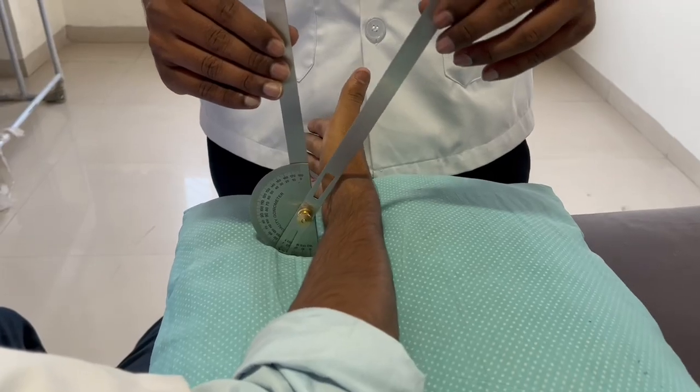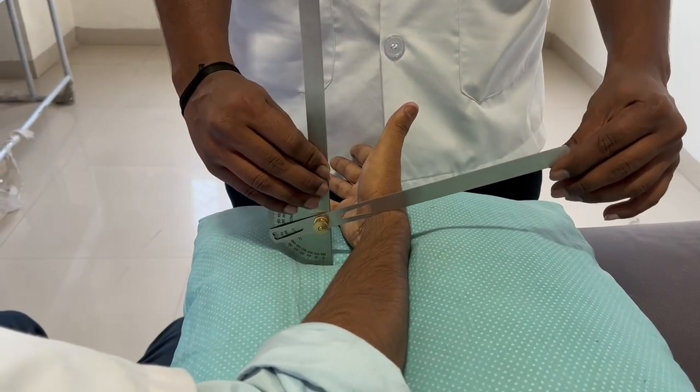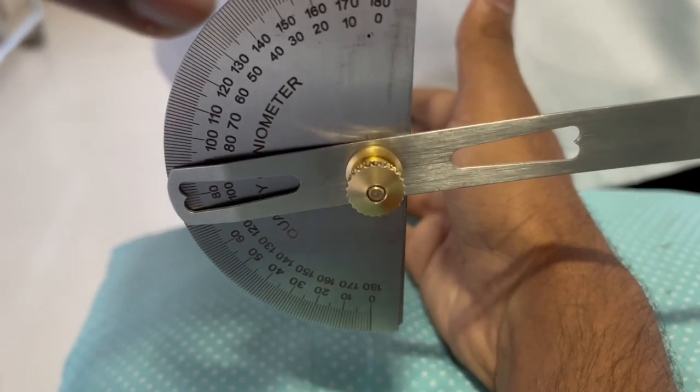Next, we'll be seeing supination. The subject position is the same as for pronation. The fulcrum should be at the medial ulnar styloid process. The stable arm should be parallel to the midline of the humerus, and the mobile arm should be across the volar aspect of the forearm, just proximal to the styloid. The normal range for supination is 90 degrees.